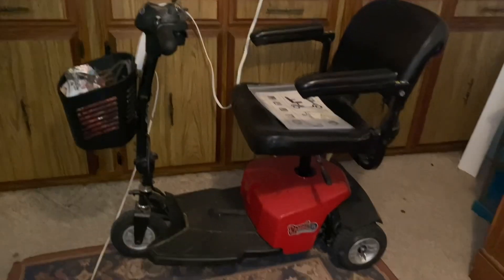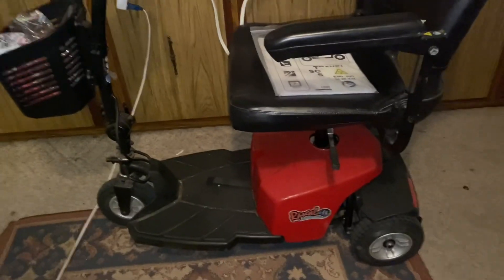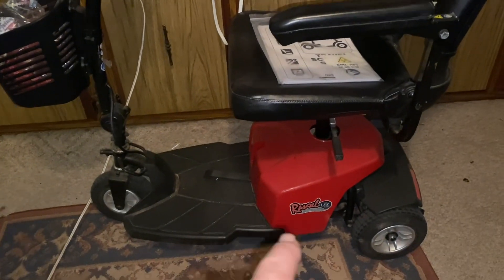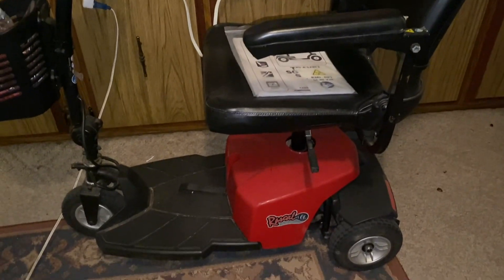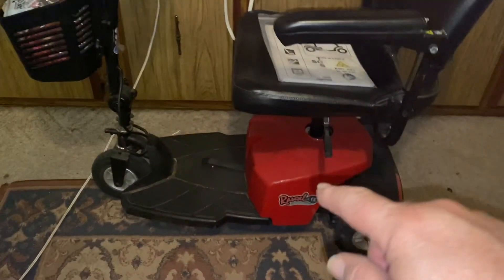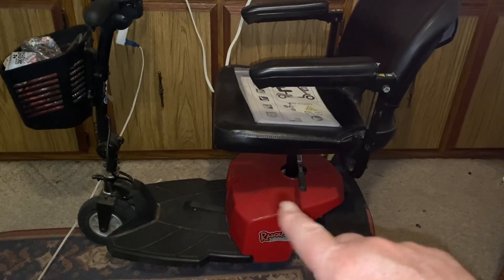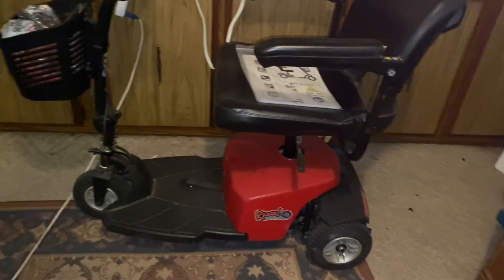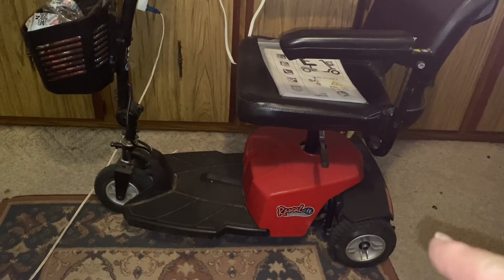Here is a three-wheeler — this one is a Rascal made by Pride Mobility. It doesn't have a battery pack in it like the other ones do. This is an older model. To get to the batteries, you have to take the seat off and then take the red shroud off, and then you can get to your battery pack. There are two 12-volt batteries in there wired into 24 volts. It comes apart where the rear end comes off.